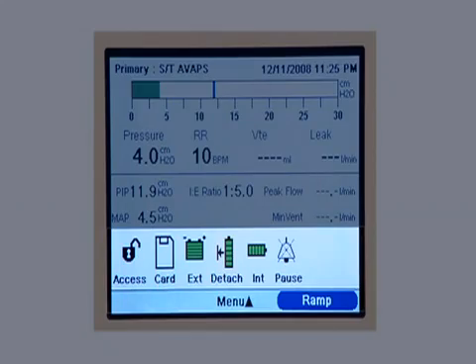Now, let's move on to the status panel at the bottom of the screen. Various symbols appear here to show what features are activated. You may see an open lock, which is an indicator used by the home care provider. You see this symbol when the secure digital, or SD memory card, is in the slot. If you see this one, there's an error with the SD card. When an external battery is attached, you see this. When the symbol is green, the battery is fully charged. The level of the green shading will go down as the battery charge decreases.